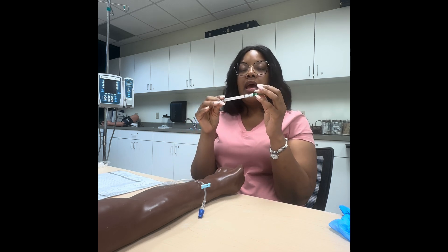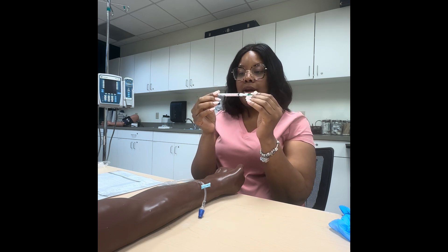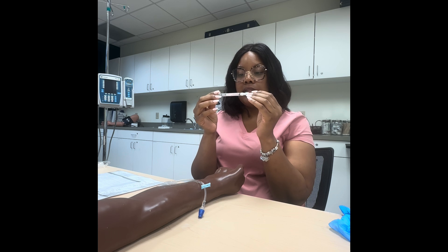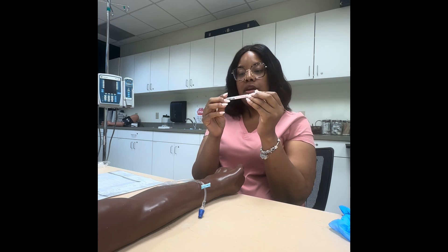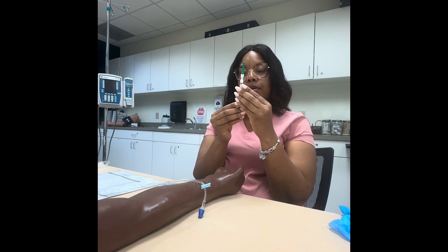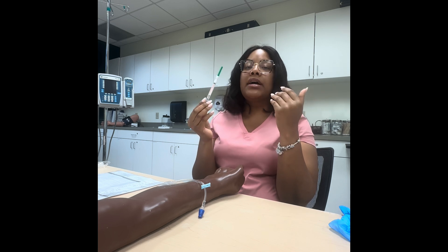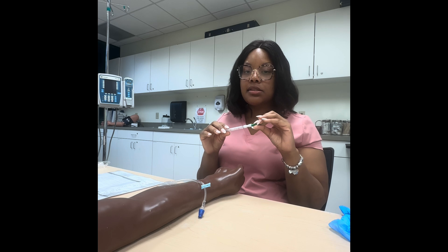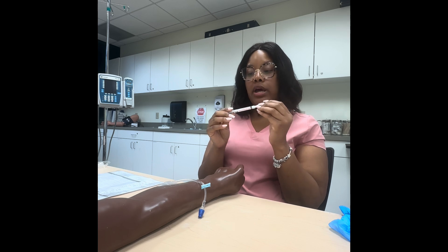Pull the correct medication from the Pyxis. This is morphine — it comes in this little vial. This is a two-milligram vial and it contains two milliliters, so there are two milligrams in two mLs. We only have to give one mL because our order is for one milligram. Two milligrams in two mLs, so we give one mL to get one milligram — does that make sense?